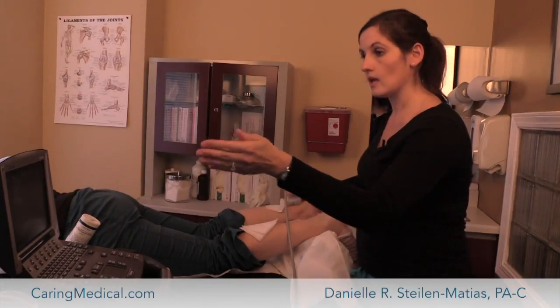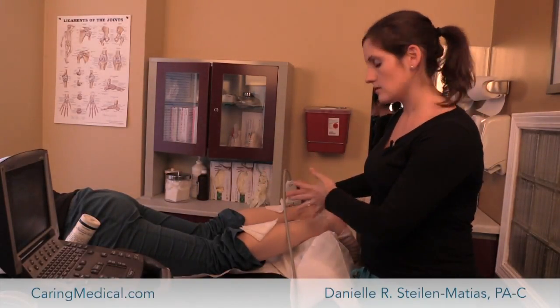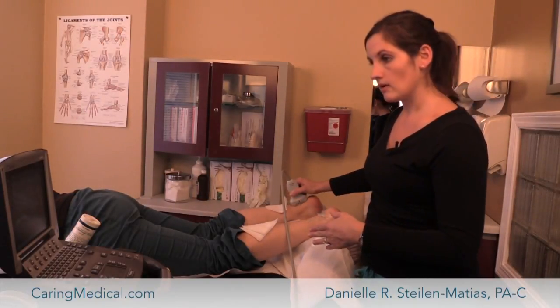So we can look and see: is it normal, is it a little bit thicker than the other side, is there something that's showing up on one side and not the other — and give us a really good picture of what's going on.